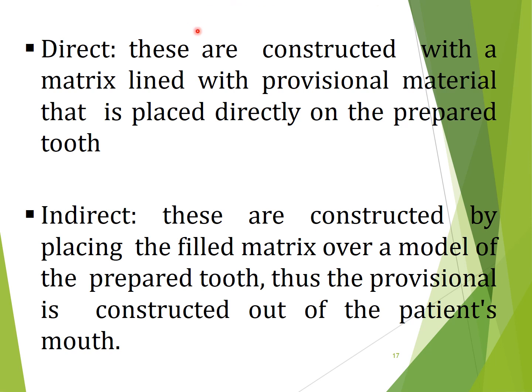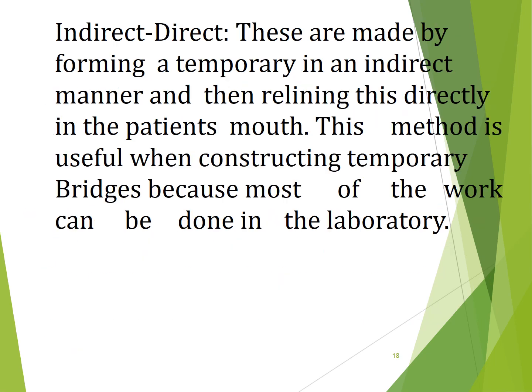Direct: these are constructed with the matrix lined with provisional material that is placed directly on the prepared teeth. Indirect: these are constructed by placing the filled matrix over a model of the prepared tooth. Thus, the provisional is constructed outside of the patient's mouth. We are using indirect-direct here in our college.